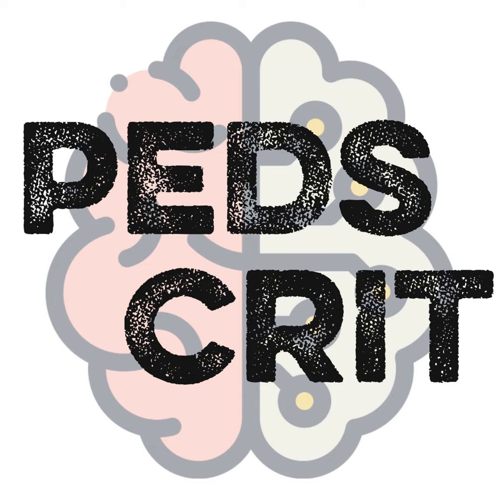And so I tend to be a little bit later to come off, especially on a VV patient, because I'd rather really get them better first as much as I can. Now, if they're having complications, if they're bleeding, if there are other issues, or if we realize that they don't have a reversible illness, or they're not a transplant candidate and their illness isn't reversible, that's a different conversation.